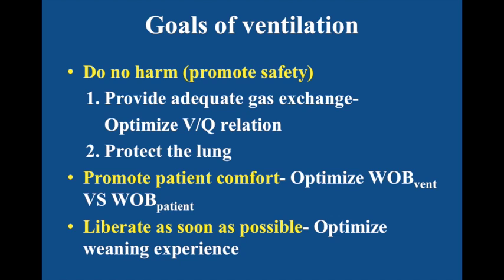Modern lung protective strategies of mechanical ventilation include low tidal volume ventilation and the continuity of spontaneous breathing, which has been shown to be beneficial in reducing atelectasis and improving oxygenation. Poor patient and ventilator interaction is a major issue during conventional assisted ventilation. That's why nowadays we should use NAVA.